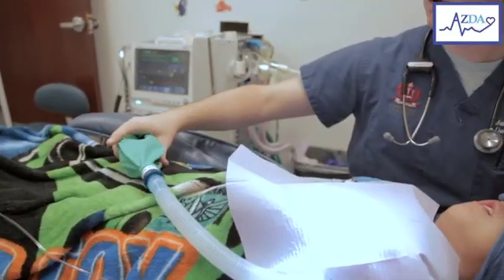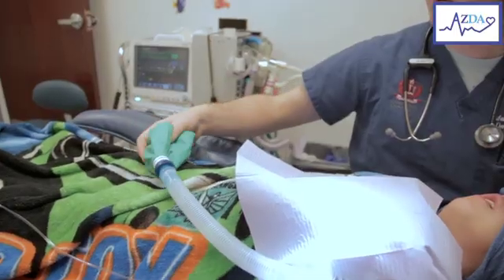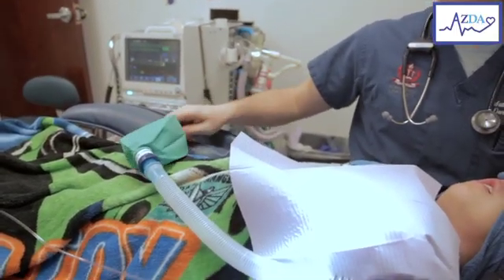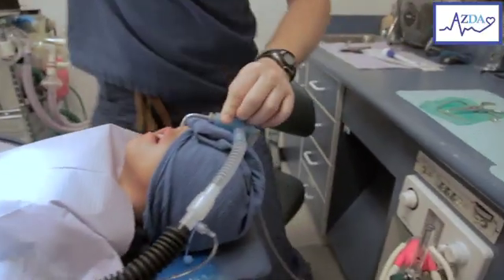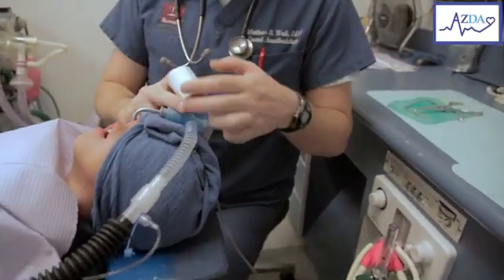Dr. Wall has given the patient a few breaths of oxygen. You can see the simplicity of this circuit. The APL valve is by Dr. Wall's right hand. He opens it up after giving the patient a few breaths to minimize the pressure that is built up.